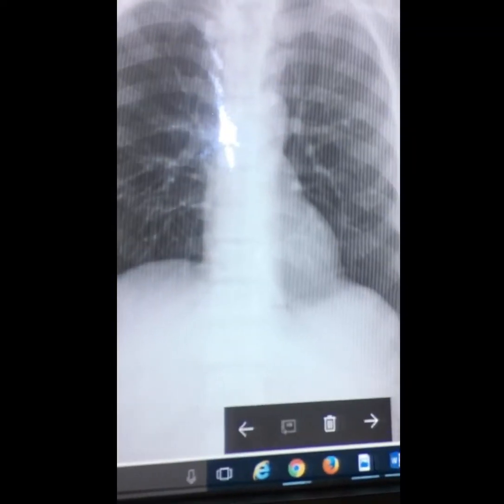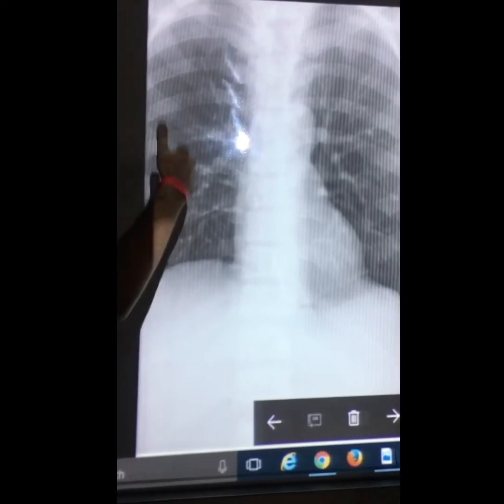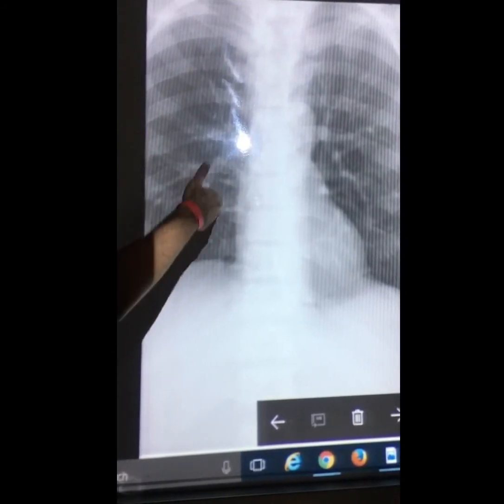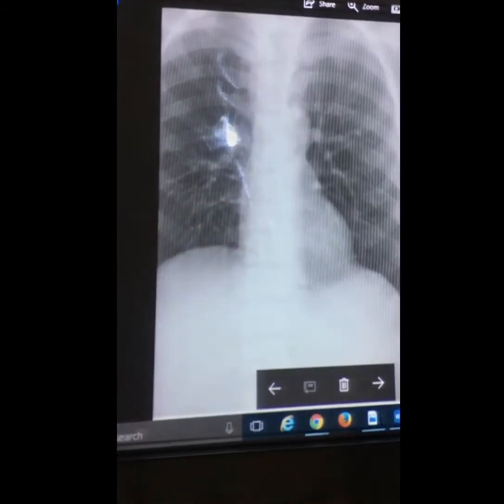So with this effect, you can still see the image, but there's always the risk of having the lines, the zebra stripes, as I like to call it, because of the double grid that we use.